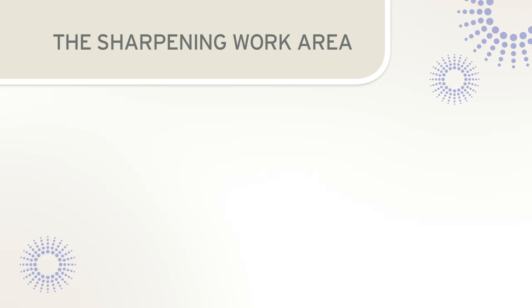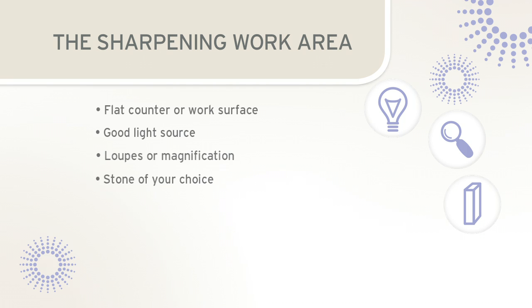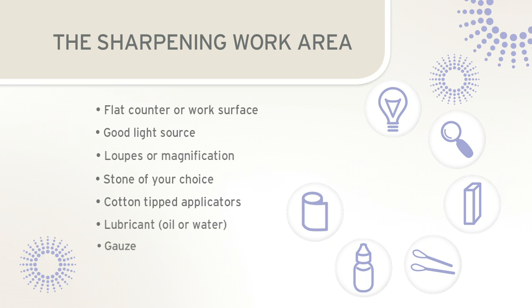Prior to sharpening, it is helpful to gather all necessary supplies. It is important that your work surface be flat — this will provide stability for your elbow and allow you to view the instrument at eye level. A good light source and loupes or magnification are vital in order to properly evaluate the edge of the blade. A sharpening stone that will best accomplish the task is required; it may be an Arkansas, India, or ceramic stone. Besides a flat stone, a cylindrical or conical stone may also be required. Cotton-tipped applicators, oil or water lubricant, gauze, and a plastic test stick will complete the sharpening work area.